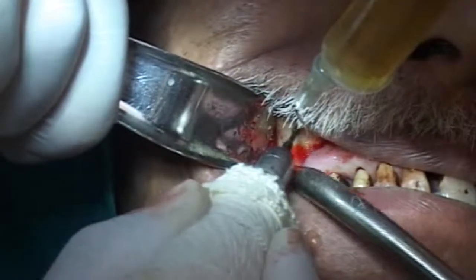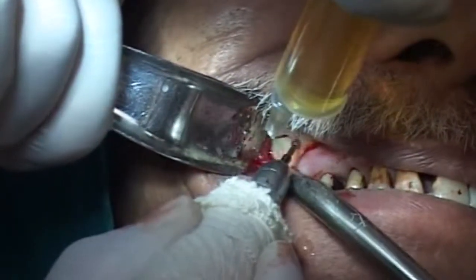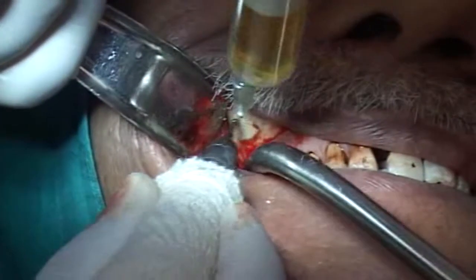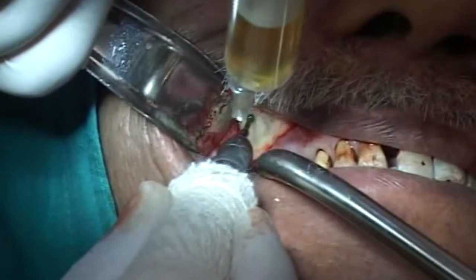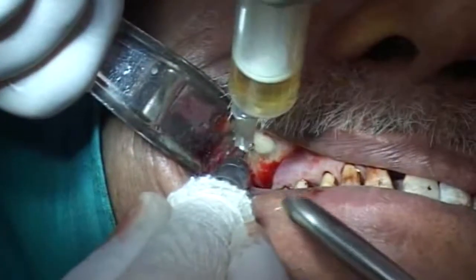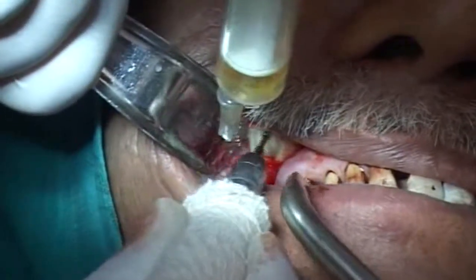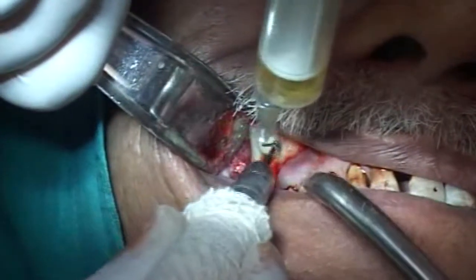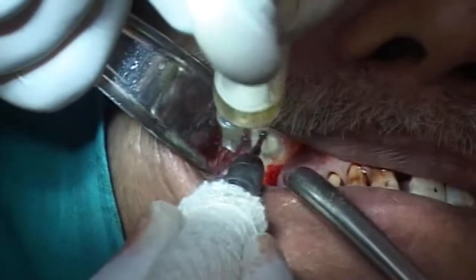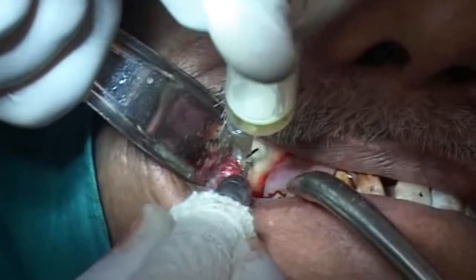The window is marked. The window should be at least one centimeter in diameter, sparing the roots of the adjacent teeth. We always use a round burr because a fissure burr leaves sharp margins and can inadvertently dip into the sinus and perforate the lining. The position of the window should be in precise alignment with the implant to be placed.